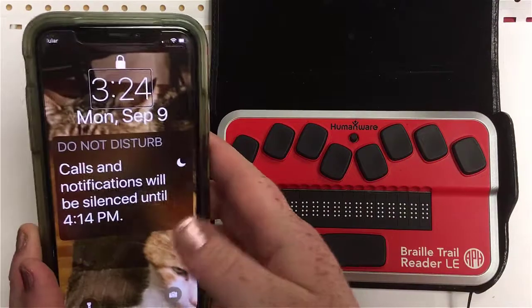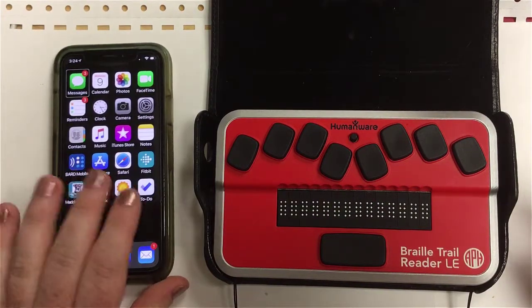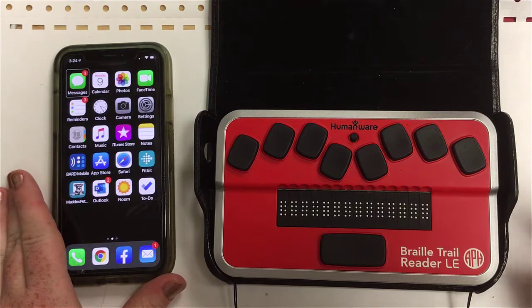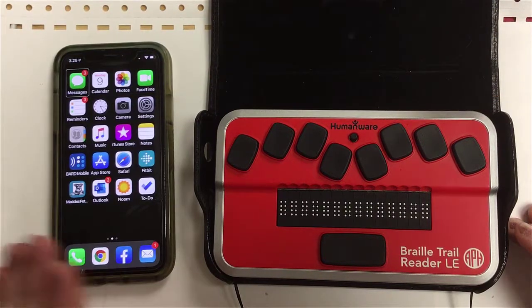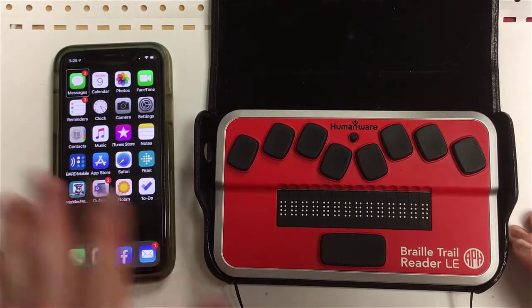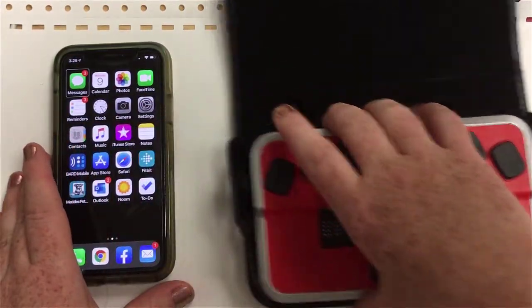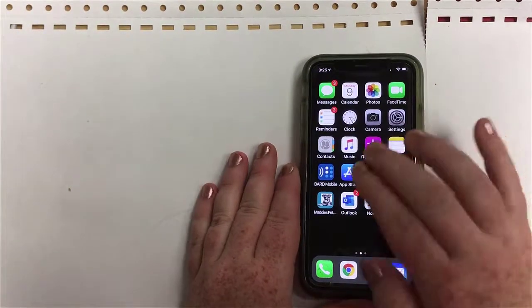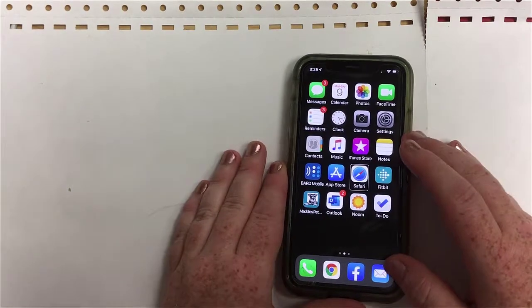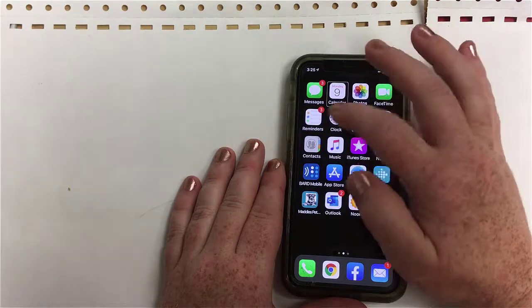This is my personal cell phone, so please excuse the cat pictures. I just needed to unlock it. I have an iPhone X, which uses Face ID and does not have a home button. The first thing I need to do to pair this device is move my BrailleTrail over a little bit and put the phone more center so I can more easily use it. I'm going to find my Settings.